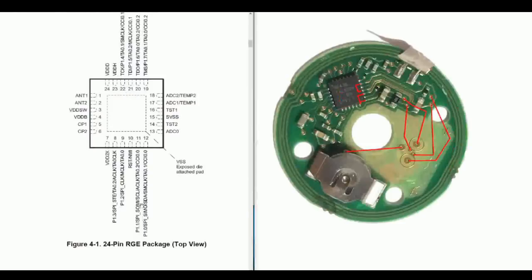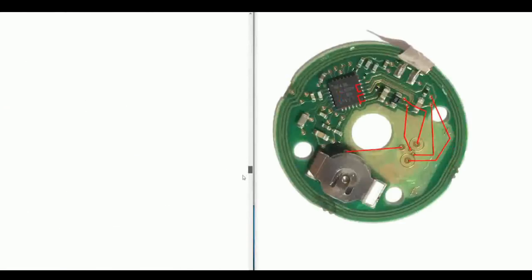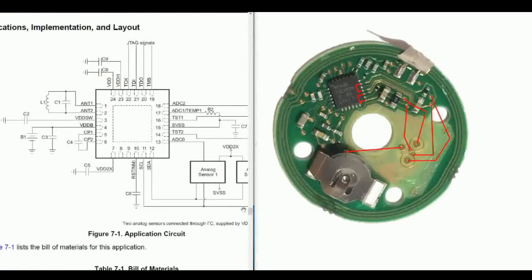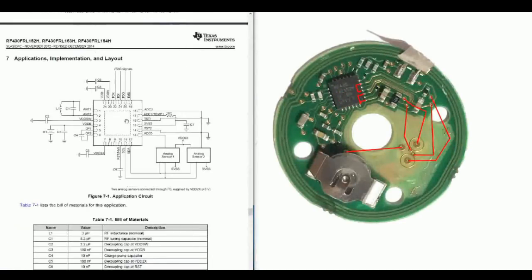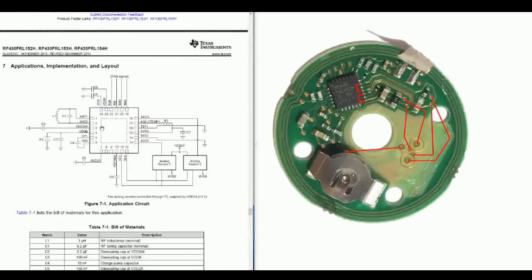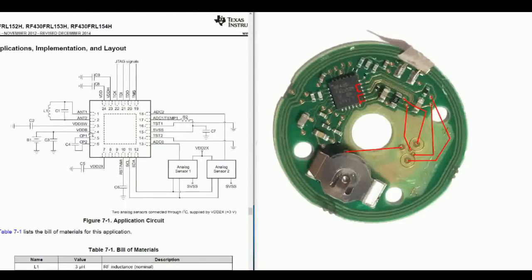Another interesting thing I saw on this data sheet was the application circuit, which shows how the manufacturer recommends this circuit be used, or one recommendation how this chip be used in a circuit. And as you can see, the antenna is connected through a capacitor, and that's what they've done here.